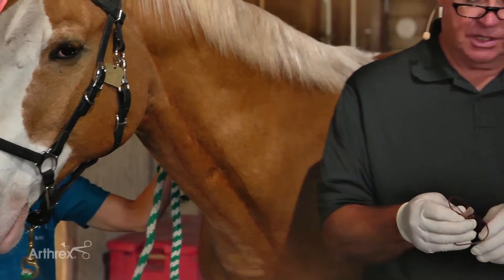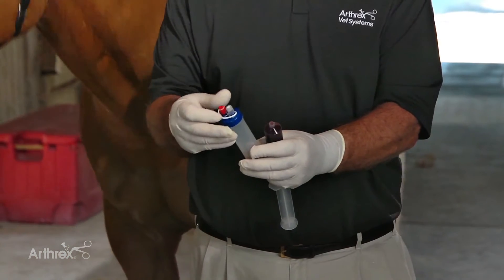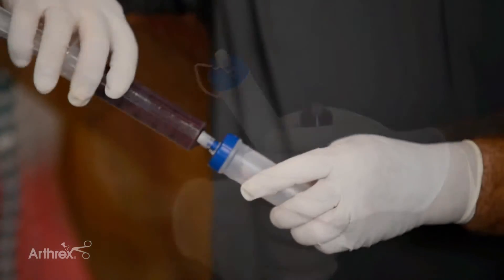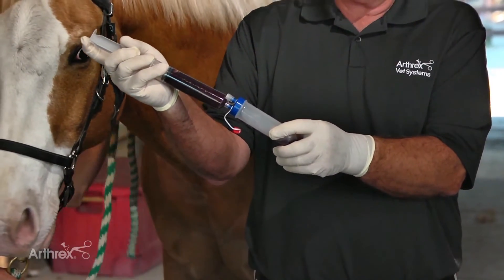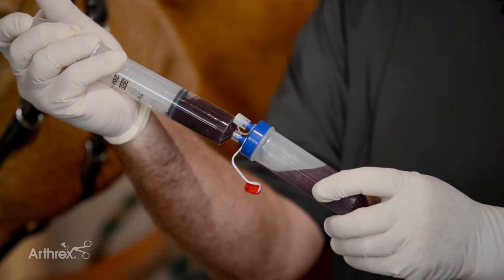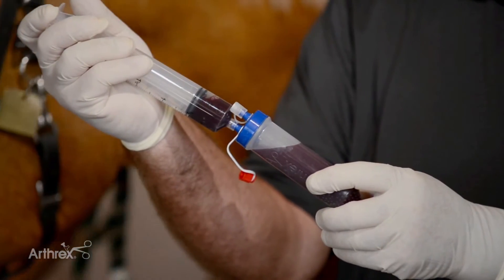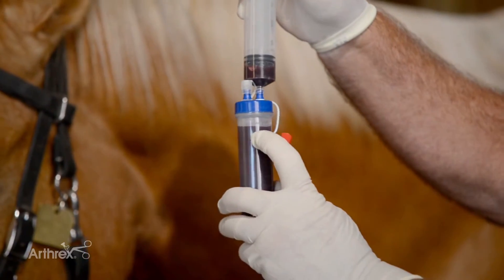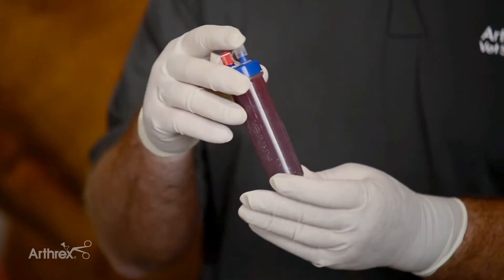Then we go ahead and transfer the blood from the syringe into the IRAP2 device. The injection of the blood goes through the red top. It's nice they have this keeper so you won't drop your red top on the floor. On this angle, gently and slowly inject the blood into the device. There's a little bevel that will encourage the blood to go right to the side of the tube instead of going all the way down — a safety mechanism so we don't get hemolysis. As we get near the top there's a max fill line, and that's where I stop, put the red top back on, and then gently rock it once or twice.